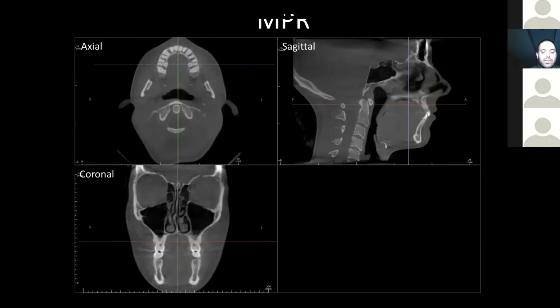It's what I use as a radiologist to review the data set top to bottom, front to back, side to side in a comprehensive manner. And when I say crosshairs, here are the crosshairs I'm referring to, right? Most, if not all, reasonable cone beam CT softwares will have some sort of lines on them. They're not always going to have colors like these ones, but they will be there. And you can use them to your advantage to keep track of where you are. Now, most of us here, I would hope, can recognize that we're somewhere in the maxilla of this patient. Okay? But if you really want to know exactly where this slice is coming from, you can look in the other views and find this orange line right here in an axial orientation and say, aha, all right, that line right there.